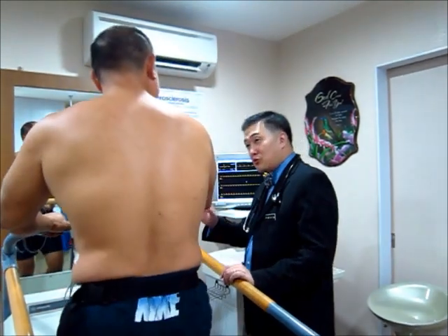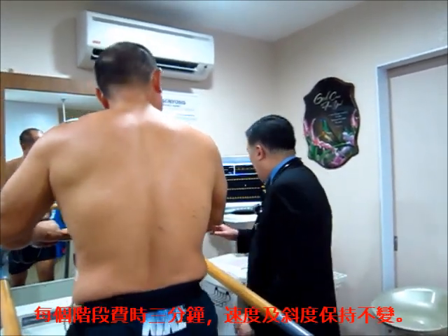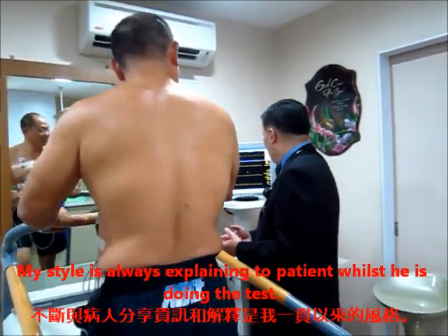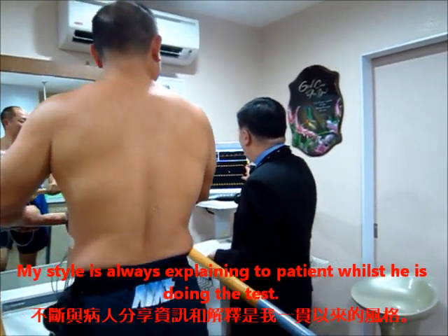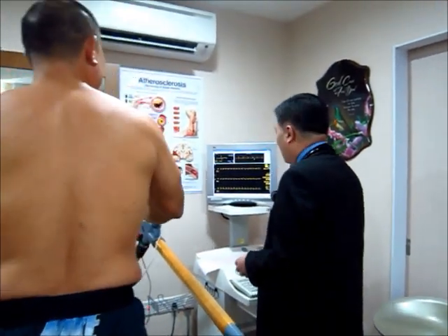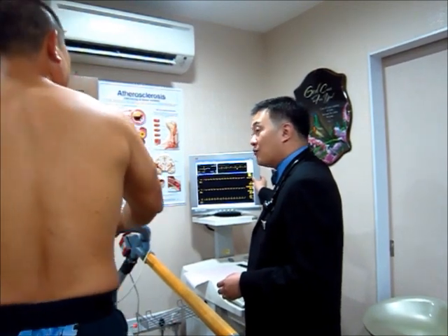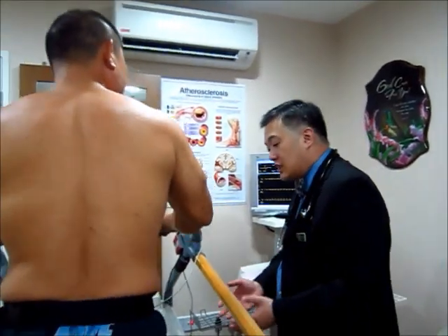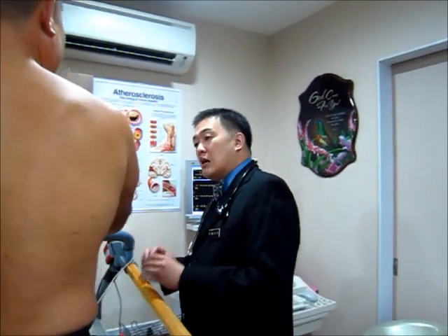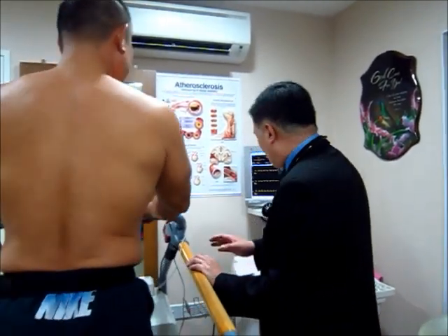Mr. Koh, every stage comprises 3 minutes. Within those 3 minutes, the speed and inclination are kept constant. When you first started your heartbeat was 71 beats per minute; now as you walk up the slope your heart rate is 96 beats per minute. You are reaching 2 minutes of stage 1, with 1 more minute to go. Because of your age, we have set a target of 173 beats per minute as the maximum. During the treadmill, if your legs are tired, cramping, or you are getting breathless or feel chest pain or dizziness, let me know right away. Please do not stop automatically — I need to press the button to slow the machine.